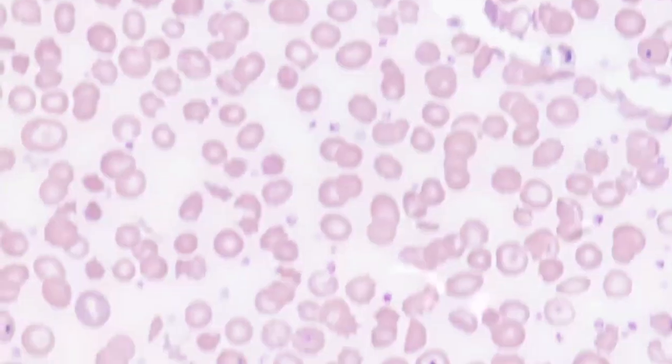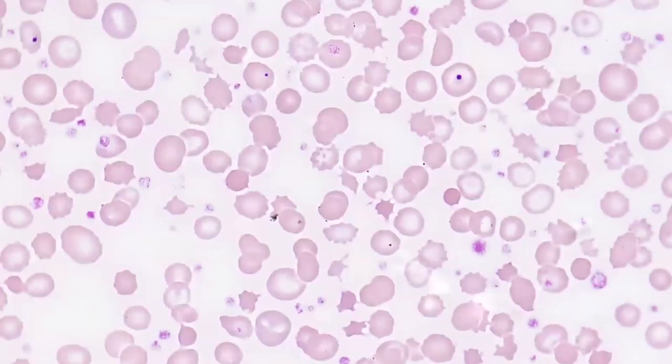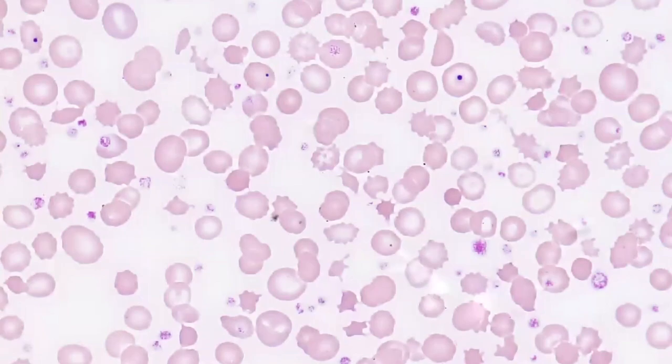In contrast to echinocytes, acanthocytes are spheroid red cells with spiny projections that are irregularly distributed over the surface. There is no central pallor as seen with echinocytes, and the presence of a large number of acanthocytes may elevate the MCHC. Acanthocytes form due to the alteration in the lipid content of the red cell membrane. Accumulation of either sphingomyelin or cholesterol is often the cause of acanthocyte formation.